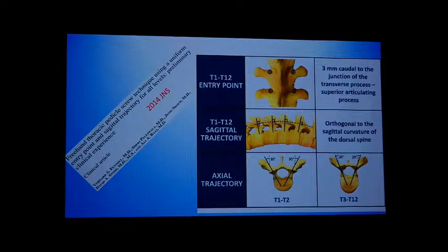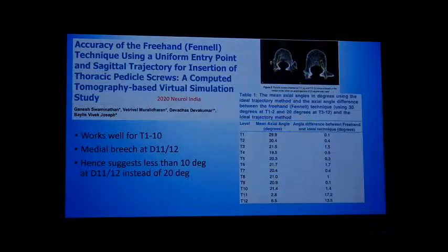And then the axial trajectory is 30 degrees medialization at T1 and T2, and at all the levels below that it's 20 degrees. Now, this can be used with a bit of caution, because sometimes at lower levels this much angulation can be a problem in some patients.